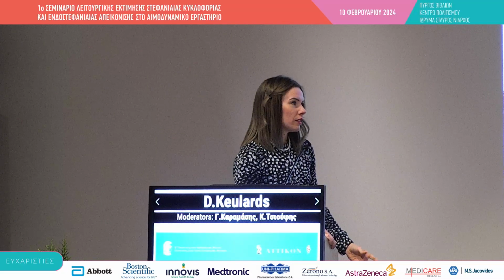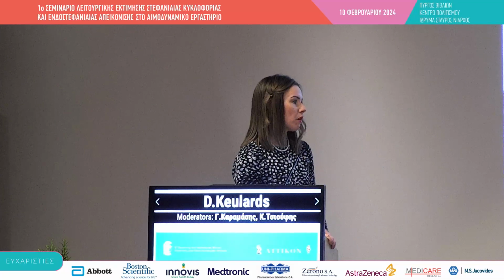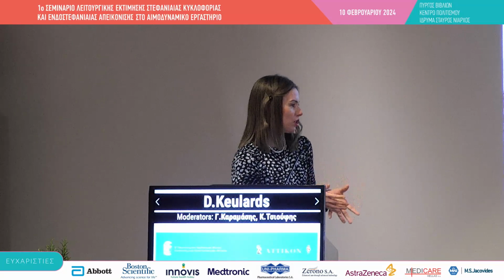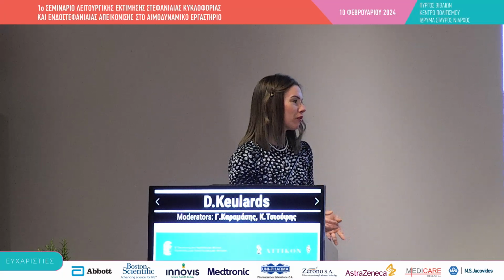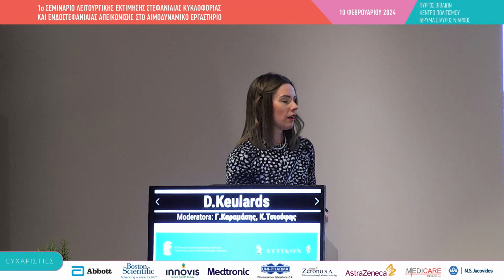And the second one is that this measurement measures actual flow, and IMR is just a surrogate of flow, because you measure the mean transit time, assuming the vascular volume is the same, which of course is not. So yeah, I think it's a little bit of a more clean version to assess the microcirculation, but it doesn't make IMR awful, of course.